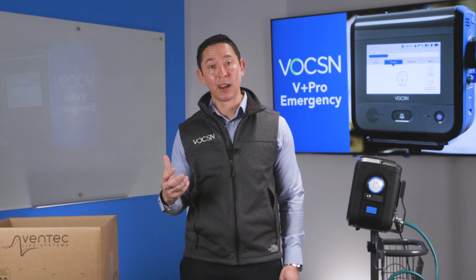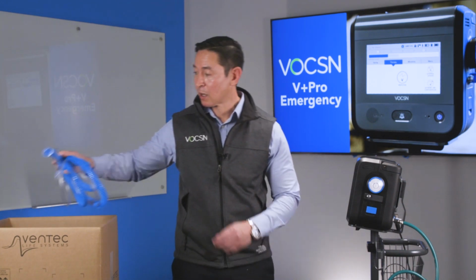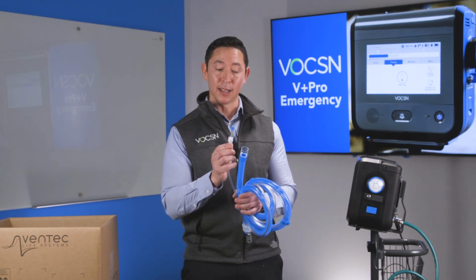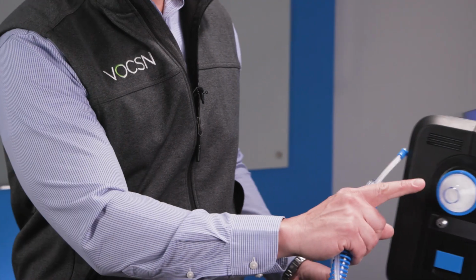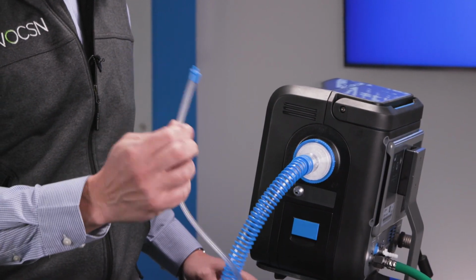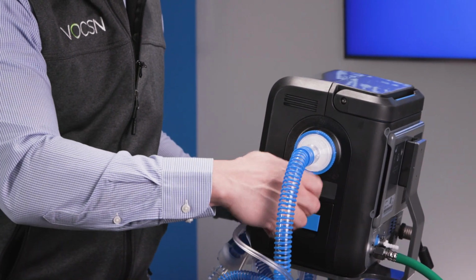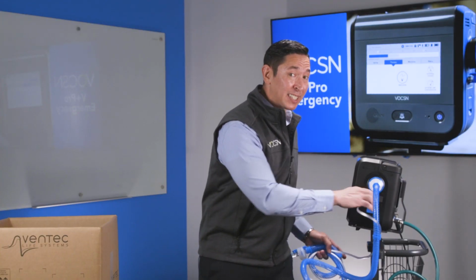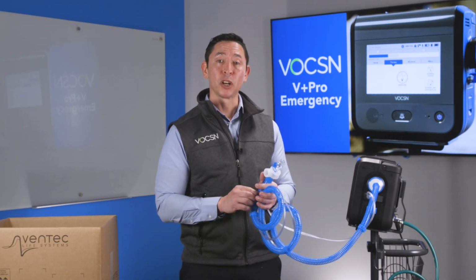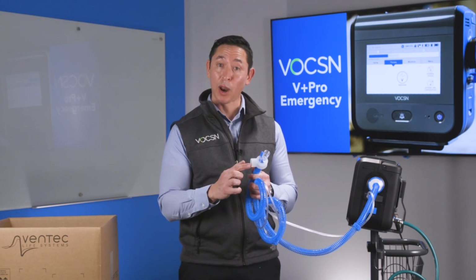The next thing I'm going to grab out of the box is my active circuit. So I've got the 22 mil cuff right here, and I have my drive and sense lines. So I'm going to connect my 22 mil cuff to the bacteria filter. And then I'm just going to connect my drive and sense lines to the active porting block. Now, I happen to have a test lung today, so I'm going to connect to my test lung. But before I do that, I just want to show you that you have the capability to filter exhaled gas by just putting a filter in right there.